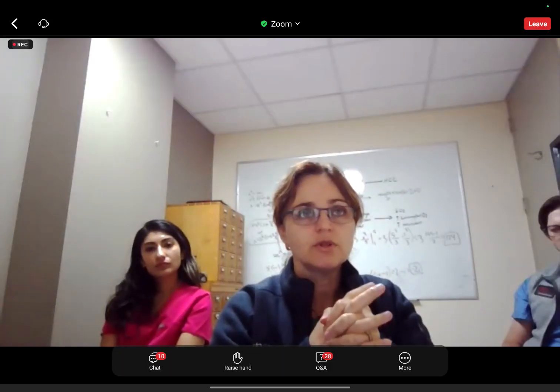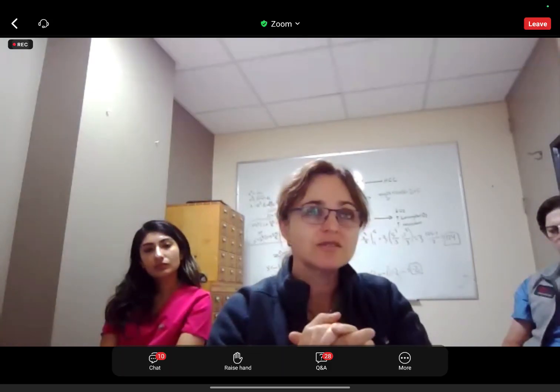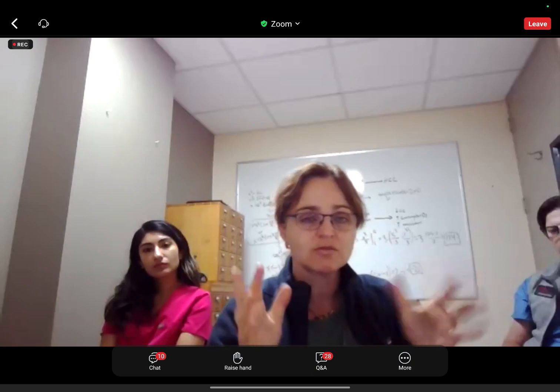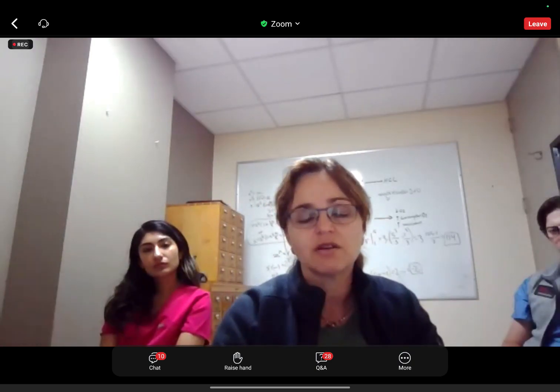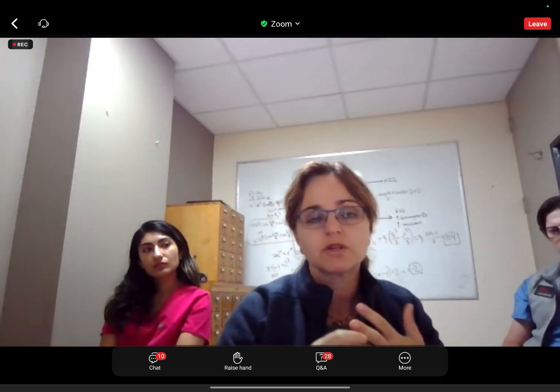So there's a little bit of finessing. You also have to make sure that CT and MR are fairly close to each other temporally. We don't have exact guidance, based on expert opinion, within a month or two, but it's a very tricky area of how to combine CT and MR features. You have to be careful, but keep in mind that CT and MR are different modalities and may or may not demonstrate features in the same manner.